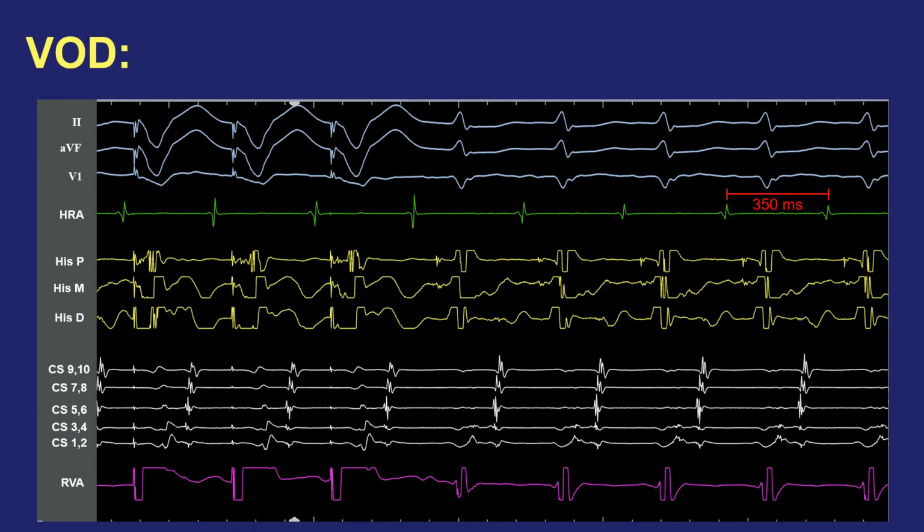Here's the cycle length of the tachycardia, 350 milliseconds. And here is our pacing rate, 330 milliseconds, 20 milliseconds faster. And we look and make sure that we, in fact, advanced the A, very important to analyzing this maneuver. Here is the last advanced A that was advanced to the tachycardia pacing cycle length. And so let's first think about the response after we come off pacing in terms of atrial and ventricular events.